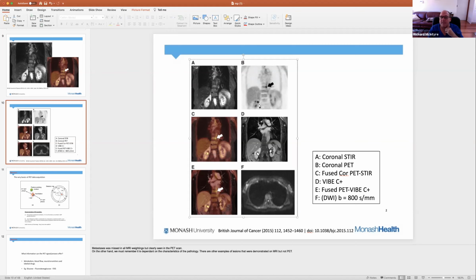Well, obviously we can see it in the kidneys because it's been excreted, okay? So we'll see increased radiation in the kidneys because the kidneys are excreting that glucose, not because they're using it necessarily, but because they're excreting it, okay? So that's called metabolic activity or functional activity. And that's what nuclear medicine does very, very well. Not just glucose, but they also use other molecules.